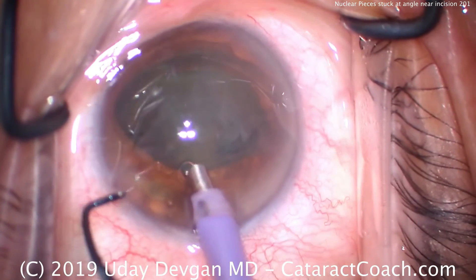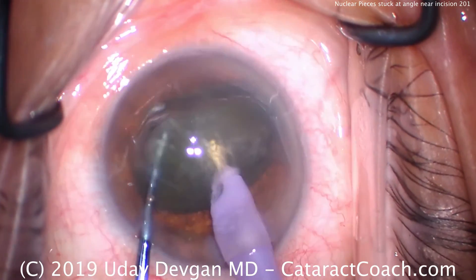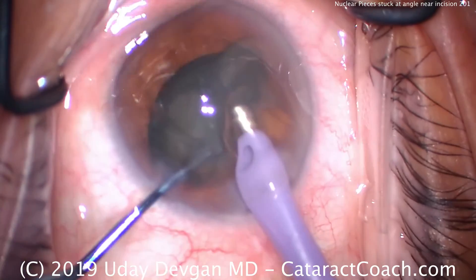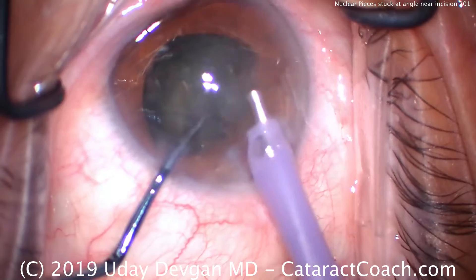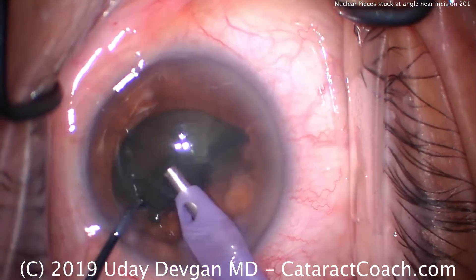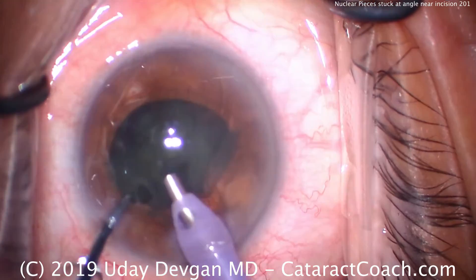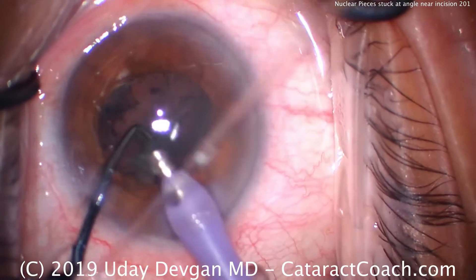Putting the probe in the eye, here comes our chopper. We'll buzz into the nucleus, chopper goes around the lens, and we can split the lens in half. Two halves immediately. Now simply keep the phaco probe occluded with lens material, and we'll be able to suck out the cataract relatively quickly. The sole purpose of the chopper at this point is to keep the pieces brought towards the phaco probe tip — see how the chopper's pushing the pieces, keeping them in front of the probe? Make sure the cataract pieces don't go under the probe; they need to be in front of the phaco probe tip.